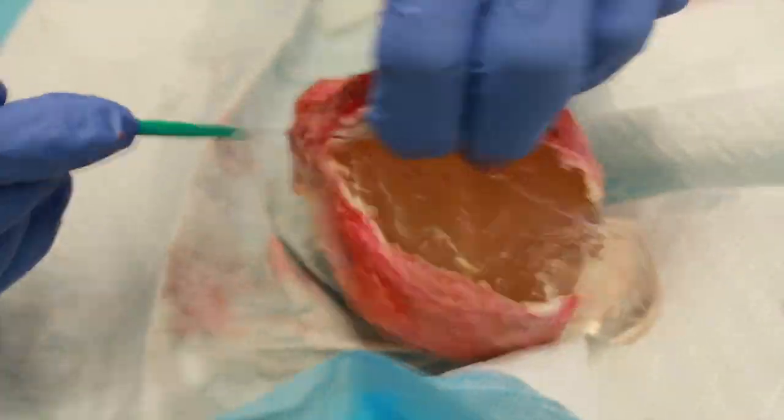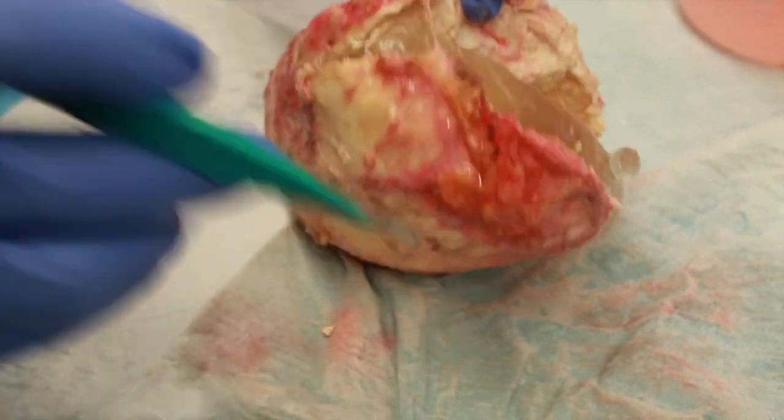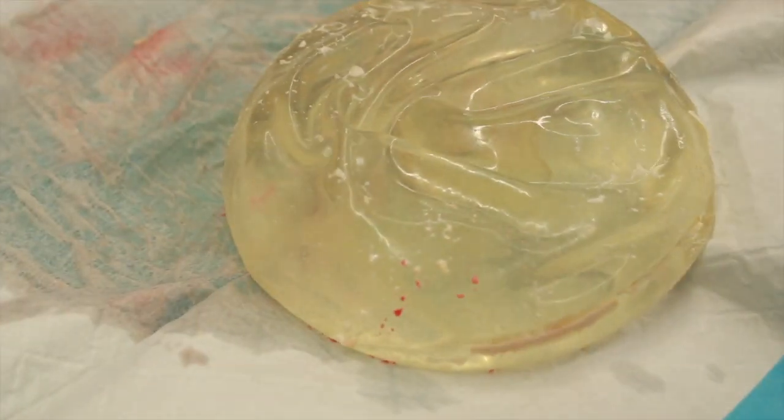We're opening it up so we can see the implant. Surprisingly, her implant was intact. We damaged it a little bit while cutting it open, but the implant itself was not broken prior to this operation.